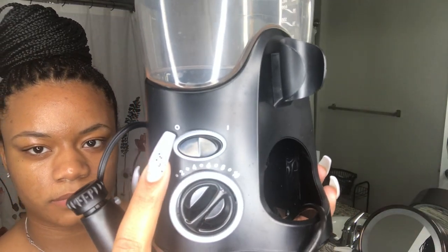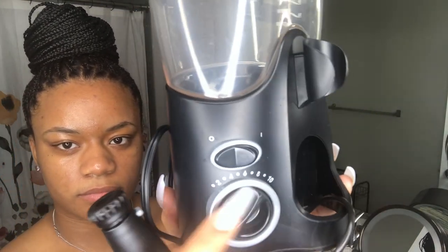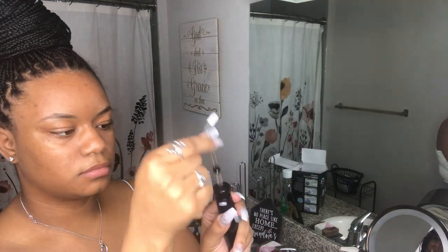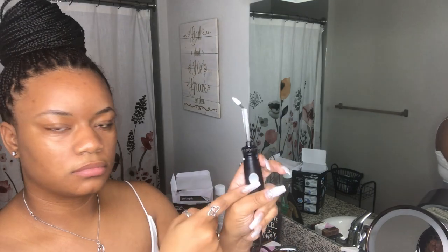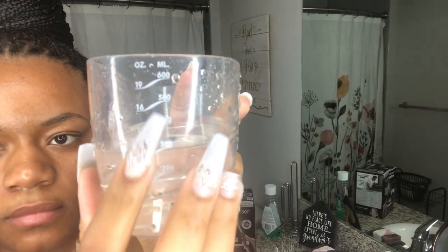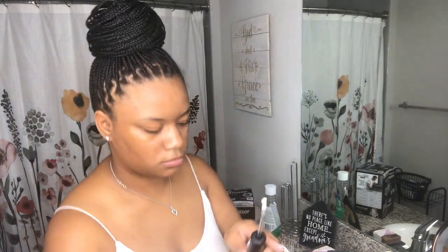So this is my water flosser. I lost my top in the midst of moving, but it still works the same. These are the main two heads that I use — one to get in between each tooth and then one to clean the bracket. I'm showing you how to take it on and off and to stop the water. This is where you add the water; they give you different measurements for how full you want it. This is me adding toothpaste to the brush to clean the brackets.